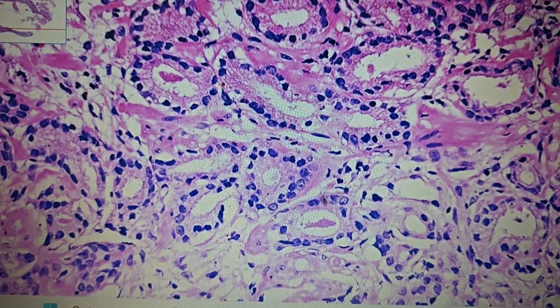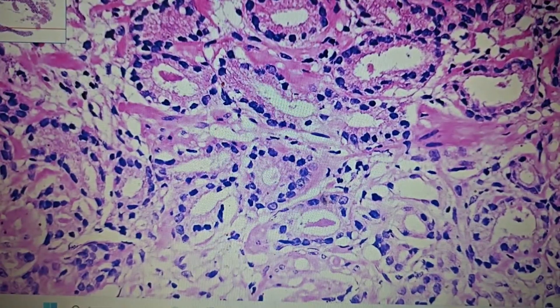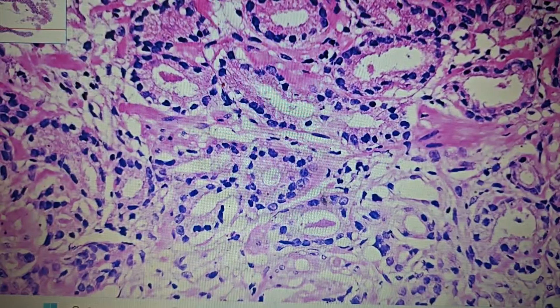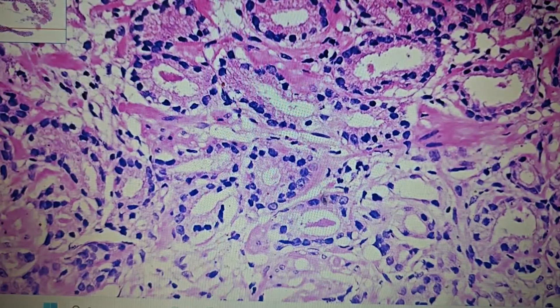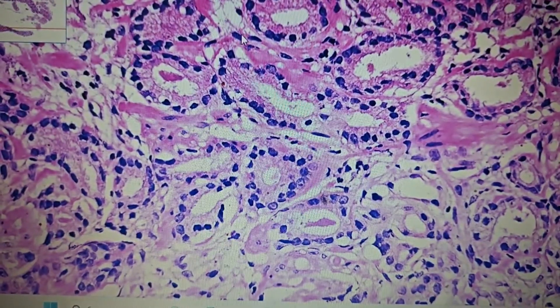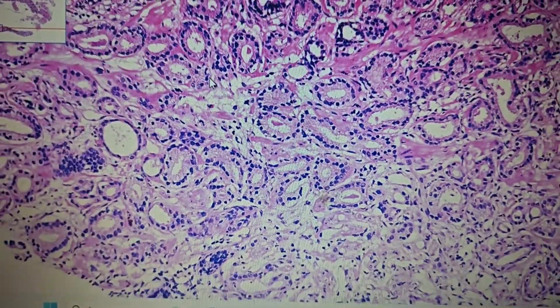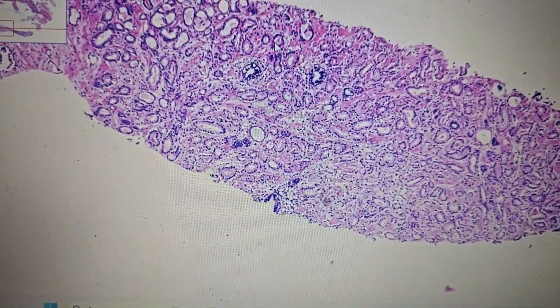In a radical prostatectomy specimen, we give the score based on the most common pattern followed by the second most common pattern, which should constitute a minimum of 5% of the tumor tissue. If there is a third pattern comprising less than 5%, we mention it in the report as a minor pattern. There is therefore a difference in Gleason scoring between the needle biopsy specimen and a radical prostatectomy specimen.